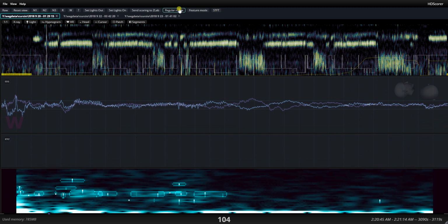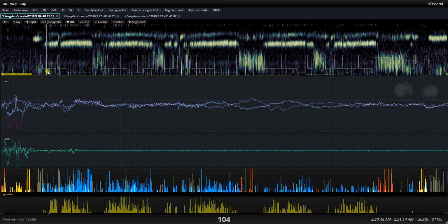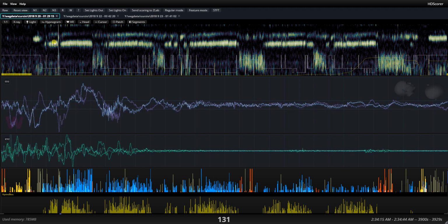transients. You will forgive me for the lack of axes both here and here, but they're going to be added soon, but it's quite trivial. So these transients right here represent the alpha waves that are going on. We have a transition between movement, and then we have alpha waves, and then we have slow eye movements. By the way, you can also see in the epoch the presence of eye movements, which would be these things here in beige color. You will see slow eye movements here as well. So to verify that, we move over here, and we see that indeed we have slow eye movements.